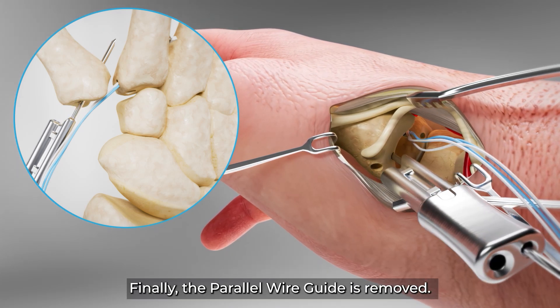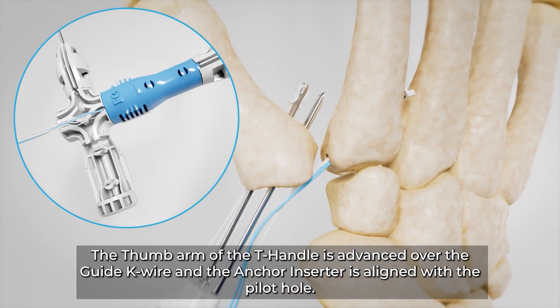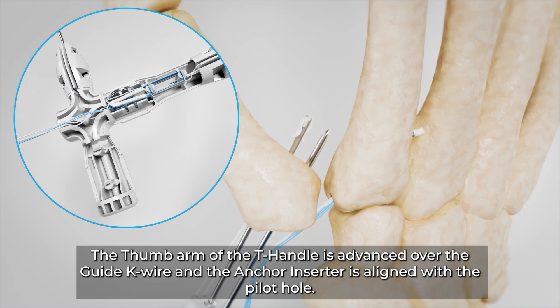Finally, the parallel wire guide is removed. The thumb arm of the T handle is advanced over the guide K wire and the anchor inserter is aligned with the pilot hole.